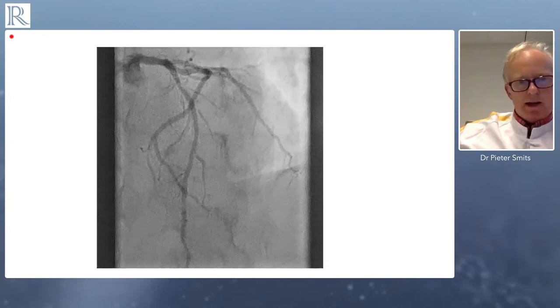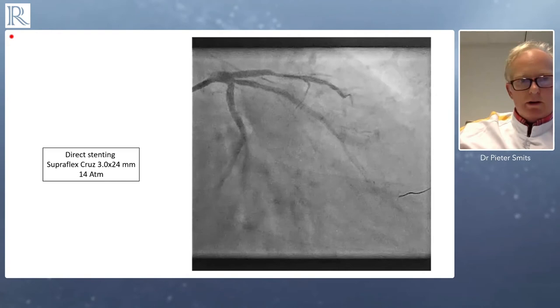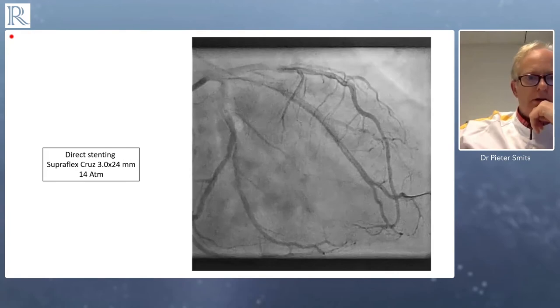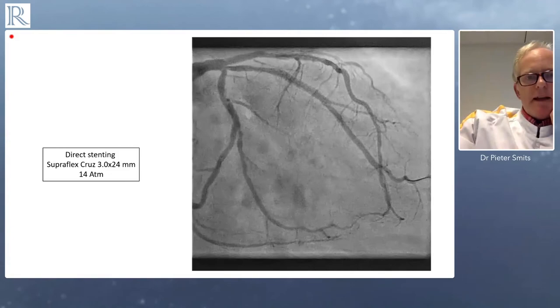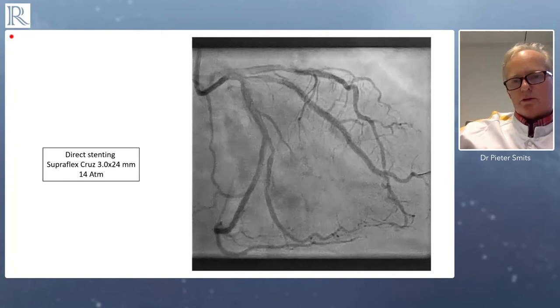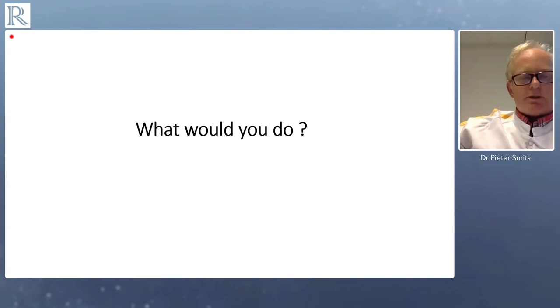This is the LAD in the cranial projection. You can see between the two small diagonal branches the old stent of 2005, and just proximal there's a lesion — not looking very severe in this projection, with some moderate disease distally. The patient was, of course, treated with direct stenting of the ramus intermedius. This is the result — a good result, direct stenting, quick and good result with nice flow. My question to Zolt and Gabor: what would you do in this case? The case was at 6 p.m. on Thursday, no acute cases coming up, but people want to go home.